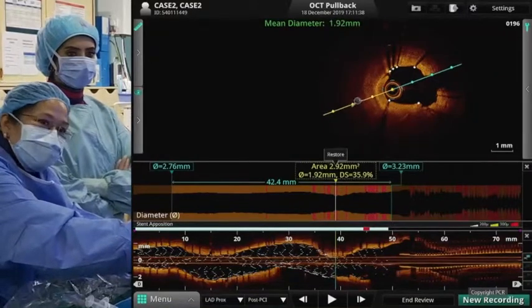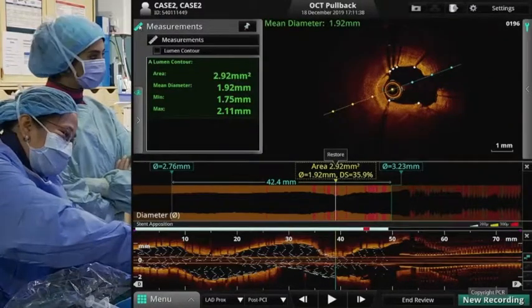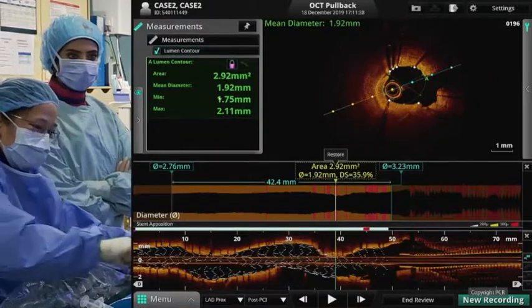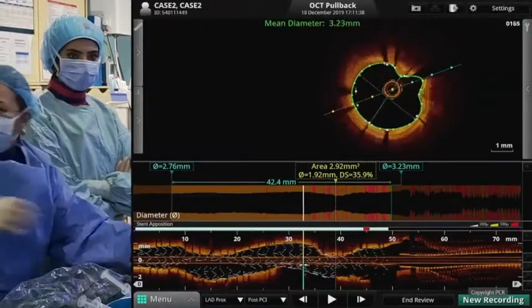It's a tortuosity, I think. Go to the ruler on the top. Amira, you're gonna walk me through this. Now say lumen contour. Click lumen contour. Yeah, this is important because, for example, in this place, the contour is actually fooling you. It's not really showing you, you notice that.